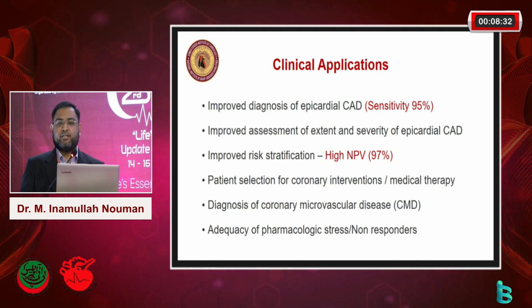There was an interesting study by Murthy et al., and that group studied up to 200 patients with PET myocardial perfusion imaging, and the interpreting physicians were given the data of the perfusion images, and they were asked to classify the cases. And again, they were given the flow data, and it was amazing that up to 50% of the cases were reclassified on the basis of dynamic imaging and on the basis of myocardial blood flow and MFR. So this shows the strength of this new novel technique.